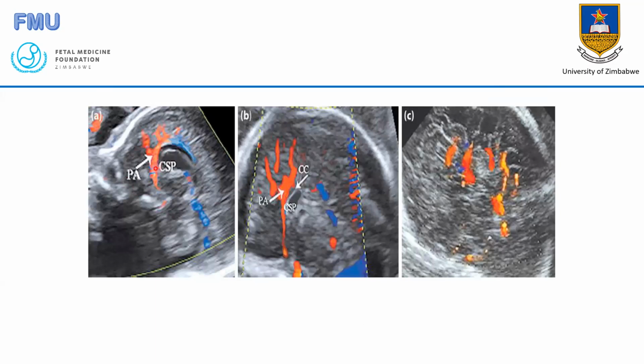This is the pericallosal artery, which I said is a branch of the anterior cerebral artery, right? So that's the pericallosal artery, which is following the corpus callosum. If the color or Doppler features of the machine are good, you can actually see it tracing the corpus callosum throughout.